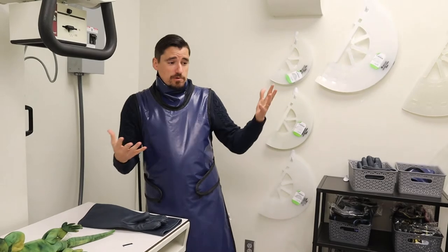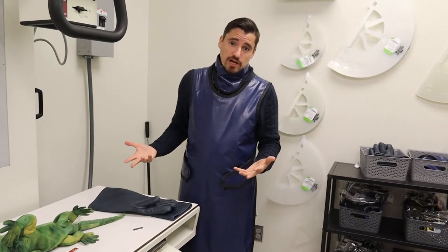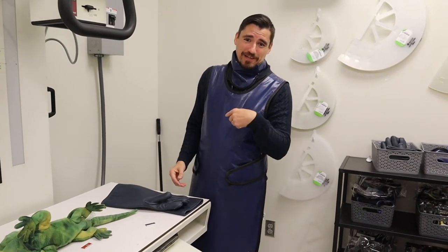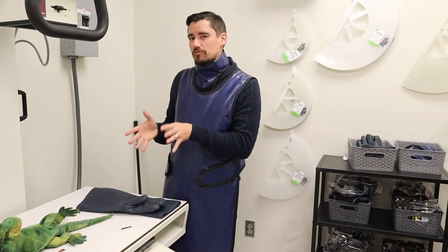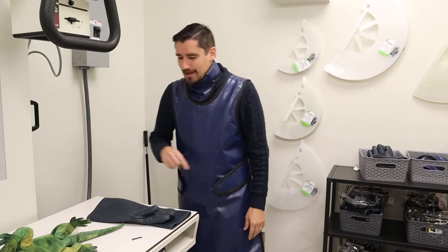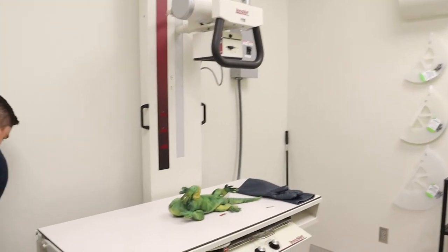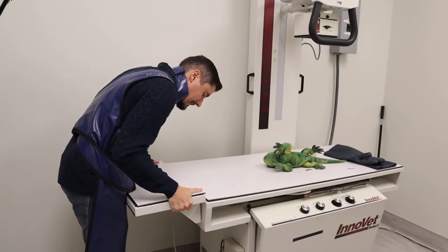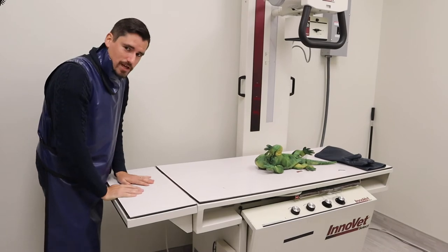Now we took our x-rays, they look good. We'll look at them, and if we can't figure it out, we'll send it off to a board-certified radiologist — they'll charge me a ton of money and send it back. But most of the time your veterinarian is going to be able to diagnose it in-house. Let's say you have a really big dog — like a mastiff — you can use this extension and plop it on there, and that allows you to get even more pet on your table.